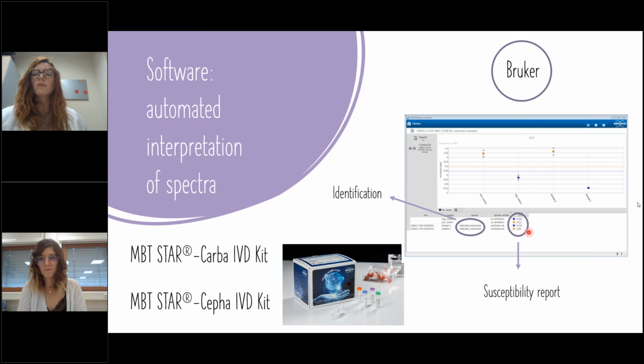That's the reason, because for that I'm using imipenem. But it is true that usually I perform an immunochromatography assay in the first place because it is simple and easier for technicians to use. But if we have any doubt, we perform the MALDI in the second place, and it is really very useful because we are seeing an increasing amount of Klebsiella pneumoniae that are resistant to ertapenem or even meropenem and lack carbapenemase.